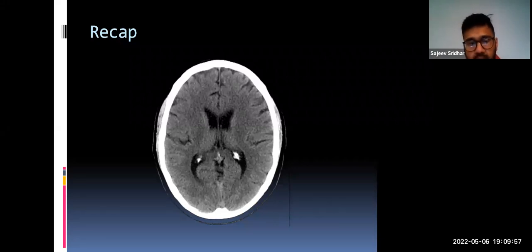Now, in my lectures about chest X-rays, we can say that the image itself that we see shows the regions of the body where the X-rays have penetrated and the regions where they have particularly been absorbed. The absorption of these X-rays actually depends on the density of the structure, and basically the differences in densities allow for the X-rays to either pass through them or to be absorbed.